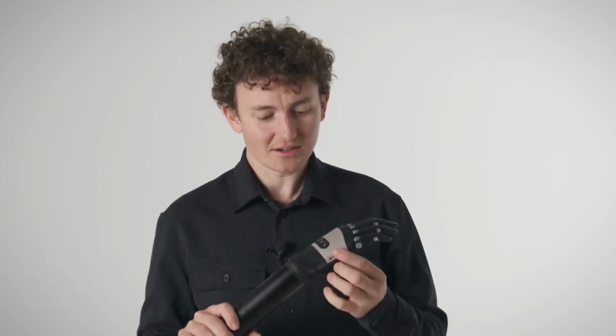The button panel performs several actions through the 3 physical buttons on the top of the device. These are the cycle button, the home button, and the lock button. These come pre-programmed with set actions.